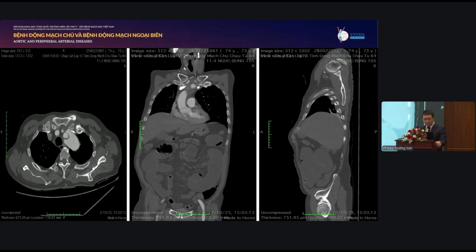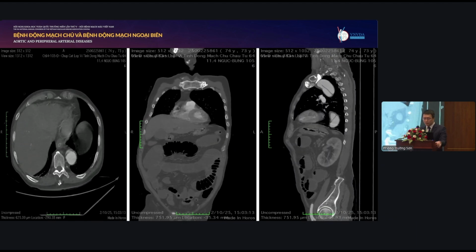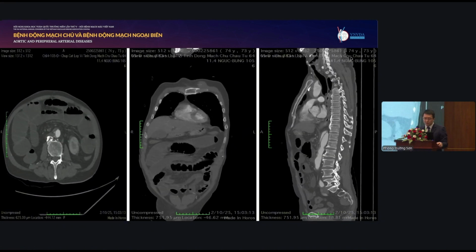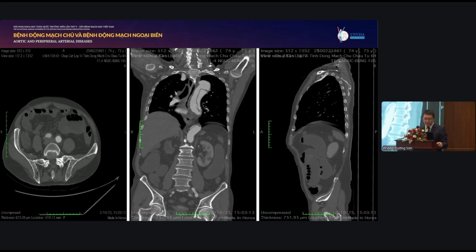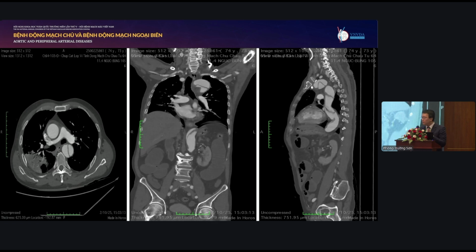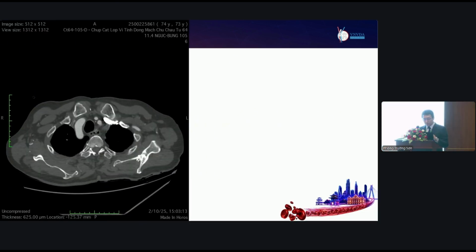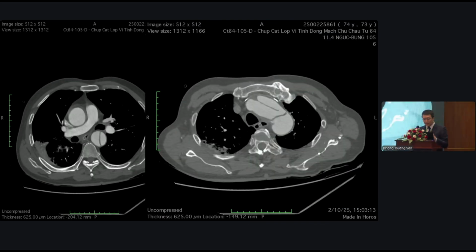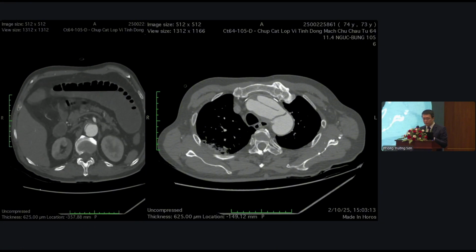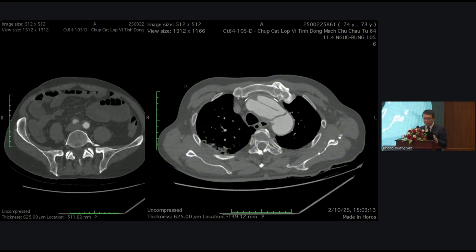You can see this patient may have a type A dissection with malperfusion to the mesenteric arteries, the right kidney, and both limbs, because the true lumen is very compressed by the false lumen. Focusing on the CT again, the intimal tear is very near the arch, and may be retrograde to type A dissection.